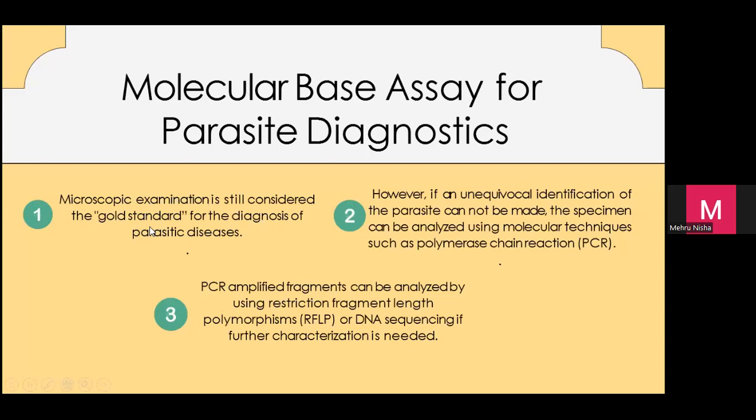Golden standard meaning this is the main thing. Kalau if you nanti nak pergi intern ke attachment anywhere, if they ask what is the golden standard method for parasite, the answer is microscopy technique. Sebab tu hingga hari ini, most of the parasite lab, they still rely on microscopy. Tapi apakah the weakness? You really need a good microscopist. Kena duduk berjam-jam baca-baca slide.